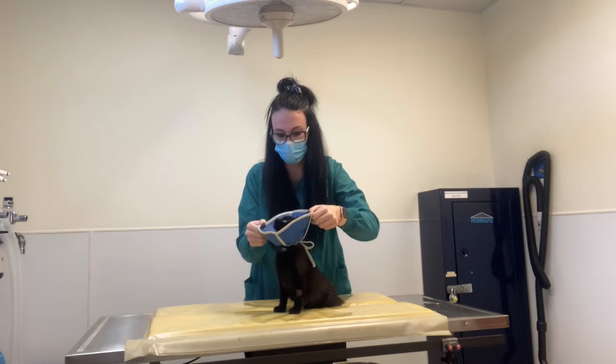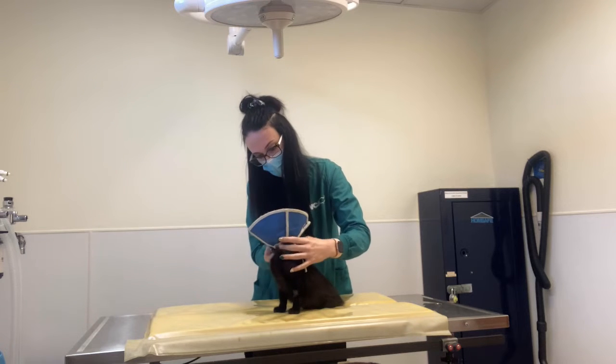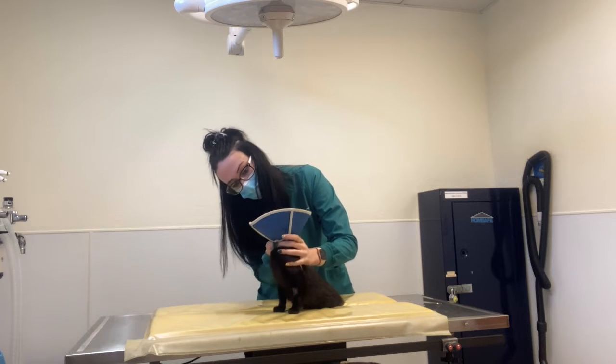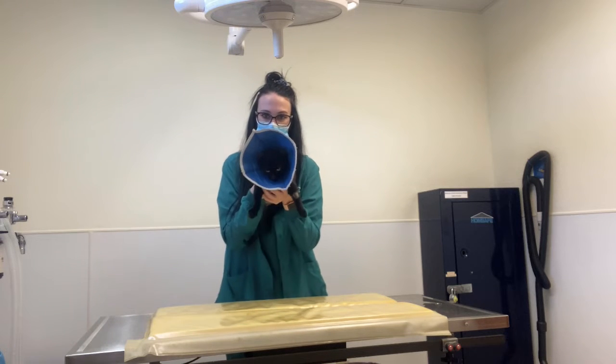Okay, so that's tied. A good test too is just to tug on it to make sure it's not going to slip over the back of their head. And like I said, 1 finger, she fits. And that's how you put on an e-collar.